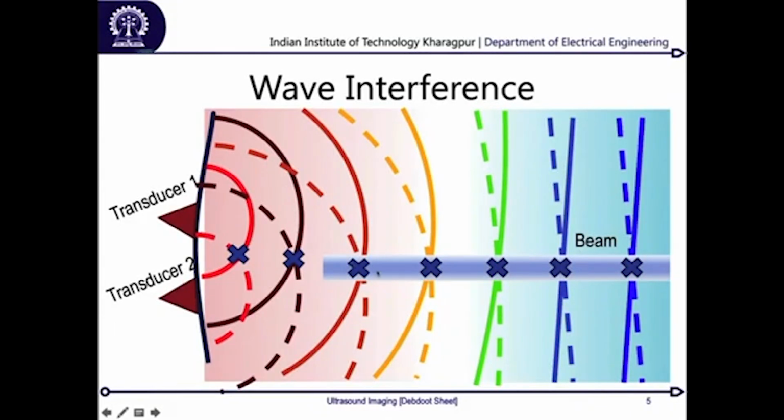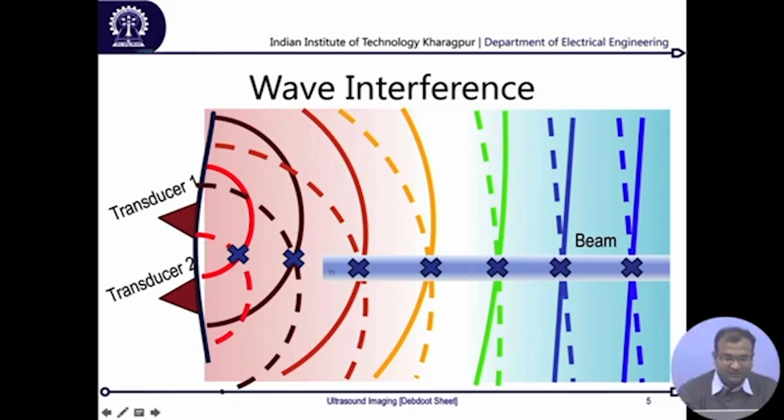Okay. Now look into one thing: as we enter the Fraunhofer zone, which is my far field, my points were aligned along a straight line on the beam, whereas in the Fresnel zone they keep on changing their location. So this is not in a long range correlation.